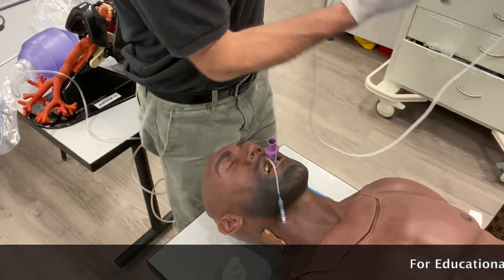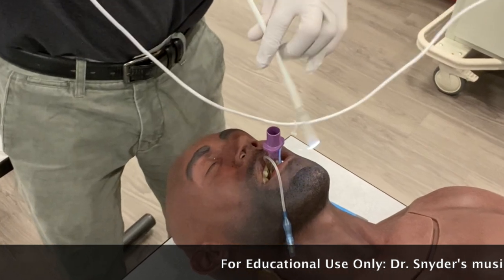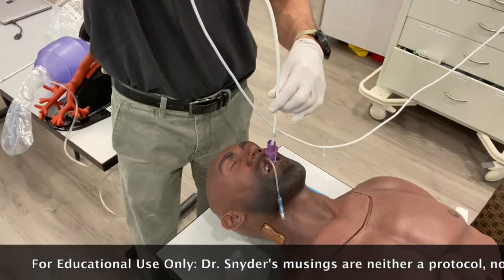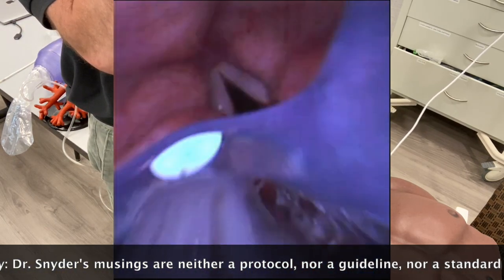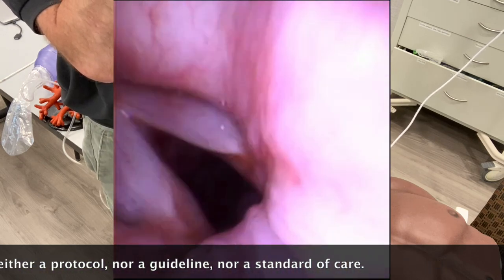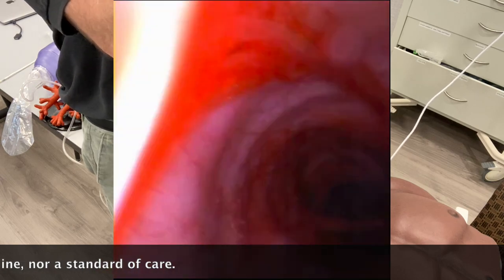Wouldn't it be nice if when a patient arrives with a King Airway or LMA in place, you could quickly and easily exchange it for an endotracheal tube between the cords without worry of complete loss of the airway or an additional hypoxic insult? Here's how you do it, but a little background first.